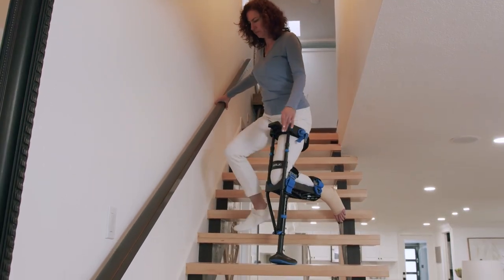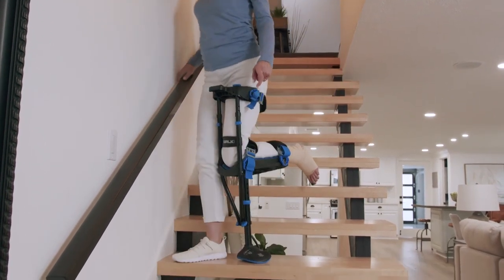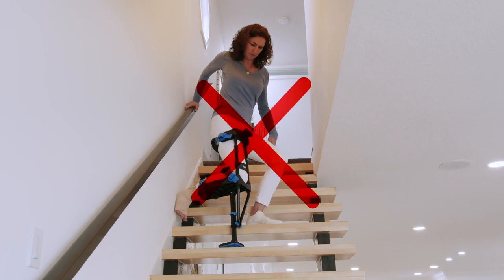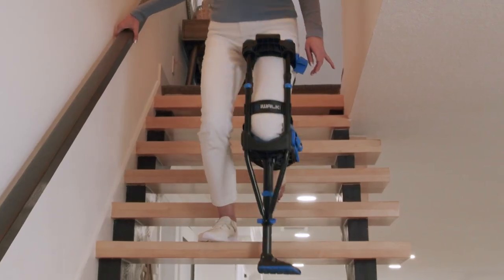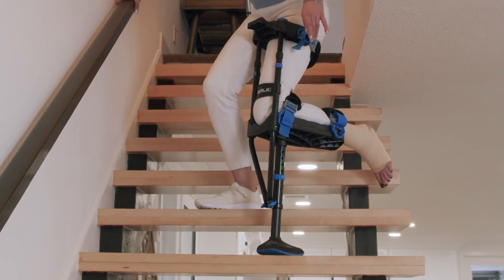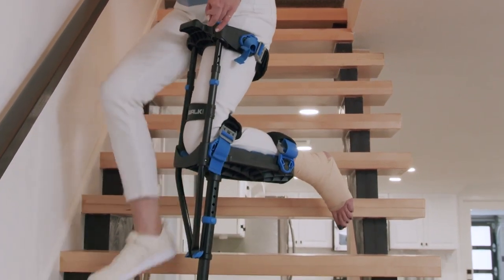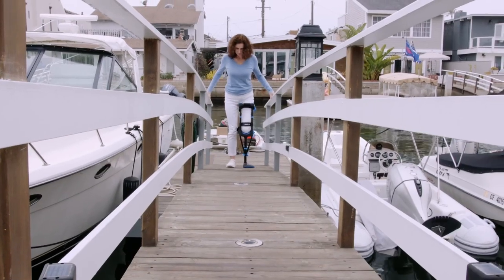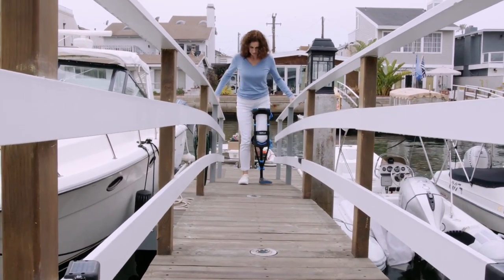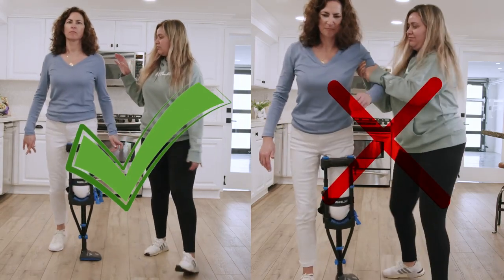An alternative method is to descend facing forward. This method only works if the handrail is on the opposite side of your iWALK leg. Start with your iWALK leg. You cannot go straight down the stairs because your injured foot may hit the uphill step. Instead, turn partially sideways before descending — this allows your injured foot to clear the uphill step. Follow with the good leg and continue descending. When walking up or down steep slopes, use the same technique as you would on stairs. If you have an assistant, try not to rely on them more than necessary, as over-reliance can increase the time it takes you to learn.